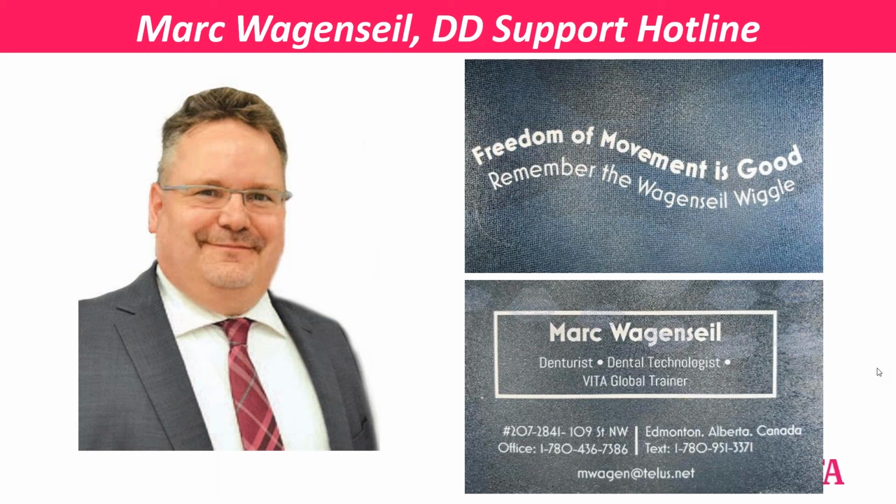That's her second part: is there no way to transfer this to the articulator in the lab? Okay, so if I remember that implant case that I showed you, she had buzzed the occlusion flat, and so I knew all of those things. I knew that she postured to her left and stuff. I didn't remount that case after it was processed because I processed it in IvoCap. So I didn't remount it. It went in. I hand looked at it once the dentures were done.